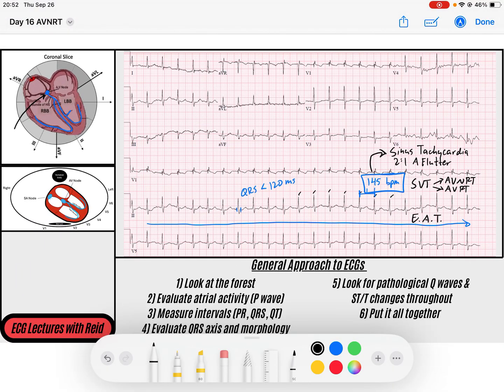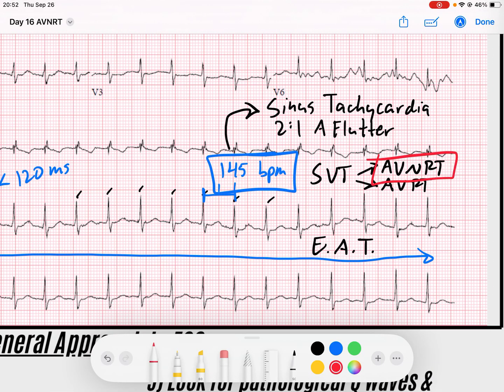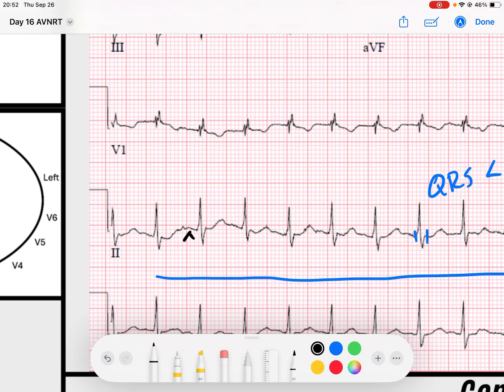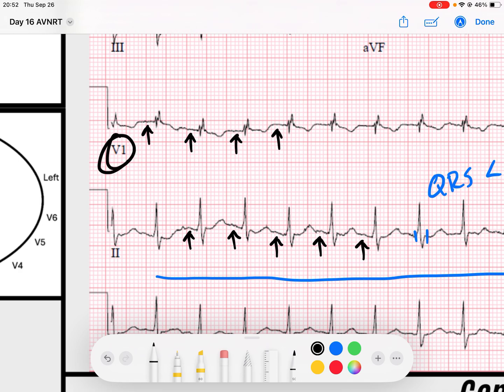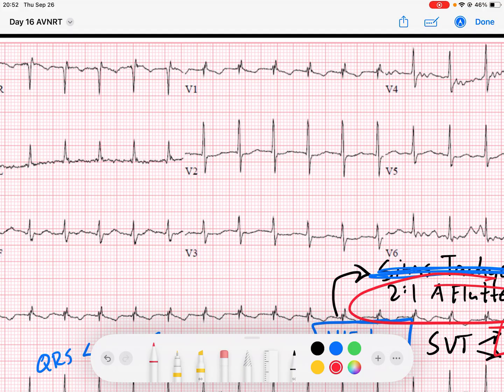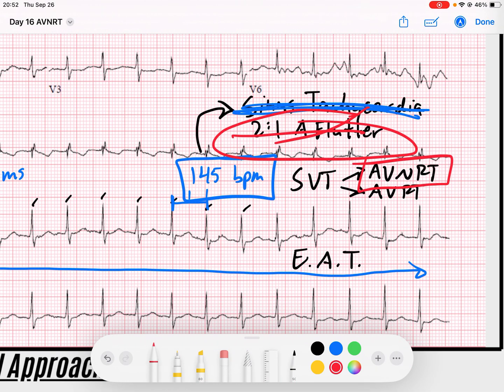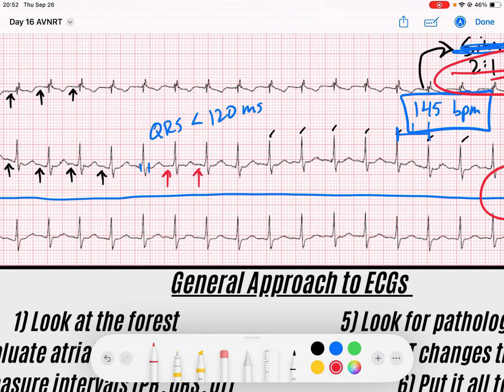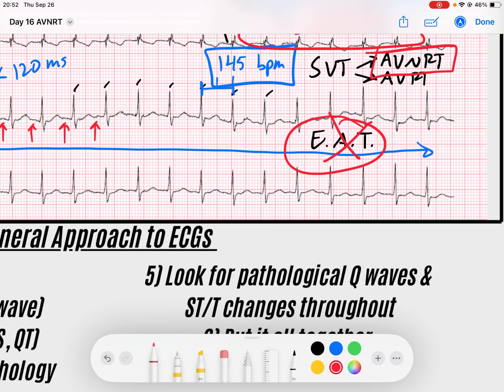How do I evaluate this? I look for sinus P waves occurring before the QRS complexes. I don't see consistent P waves — scanning through V1, which usually has nice sharp P waves, I see none. That rules out sinus tachycardia. Two-to-one atrial flutter usually shows flutter waves in V1 — I don't see any. Ectopic atrial tachycardia would have ectopic P waves in front of the QRS complexes — I don't see those either.